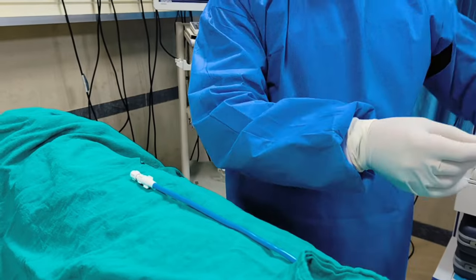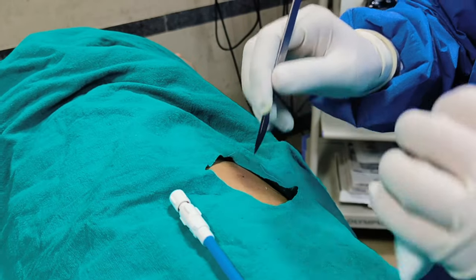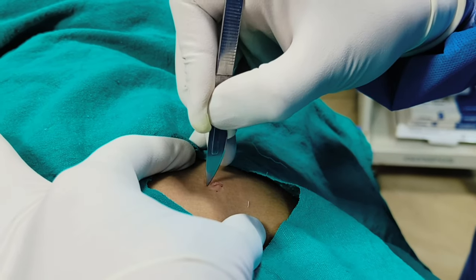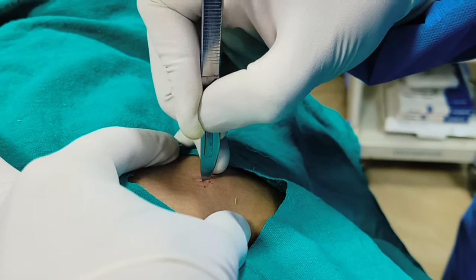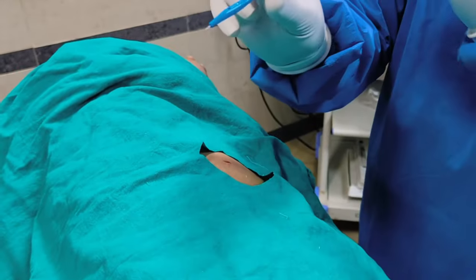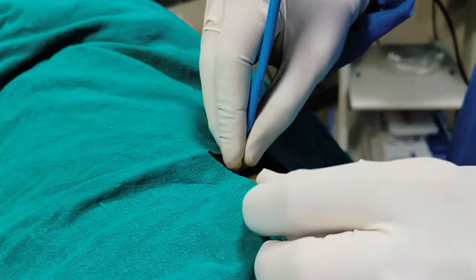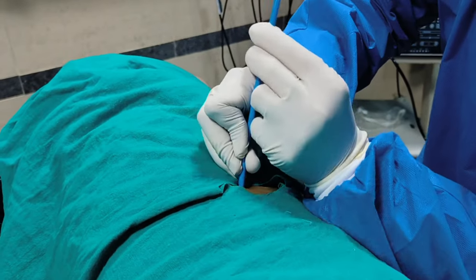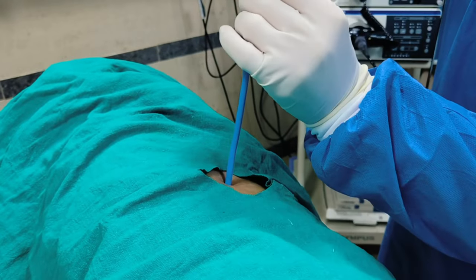Now we will take a surgical blade and first check whether pain sensation is present or not. There is no pain, so we will give a skin incision of only 3 to 5 mm, which is the width of our pigtail catheter — we will not go deeper. We will hold our pigtail like a pen and insert the tip, pressing hard because it has to pierce the muscle. We press hard until there is a feeling of give-way. Once the give-way feeling is there, we loosen the screw.